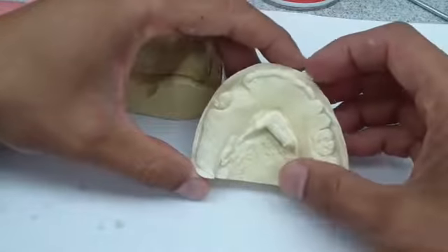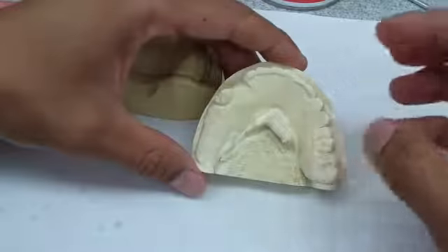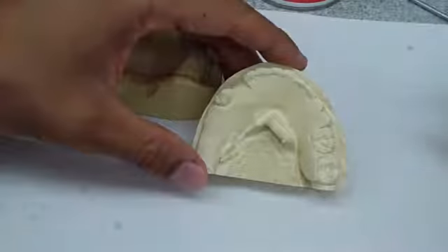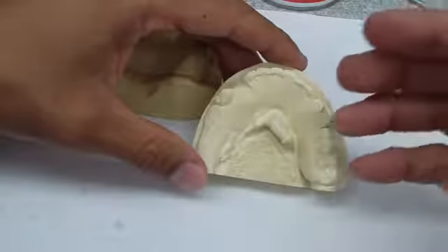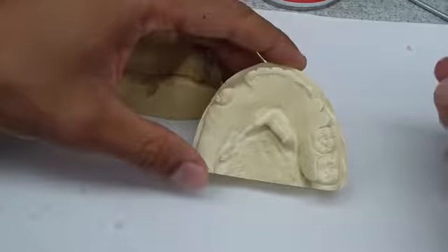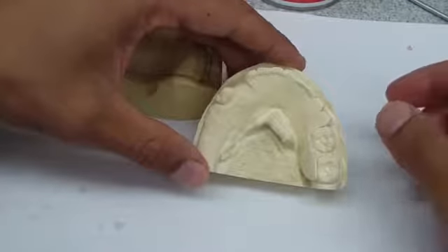fabricated a provisional mandibular partial denture that we're going to continue to use for the next few months. Aaron will be passed on to another resident to complete whatever is going to happen. He may actually have treatment time for some implants on the mandible.